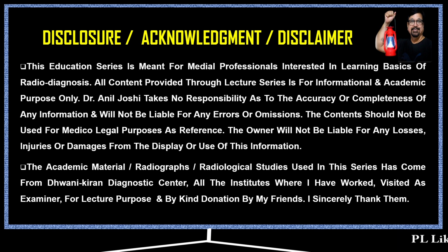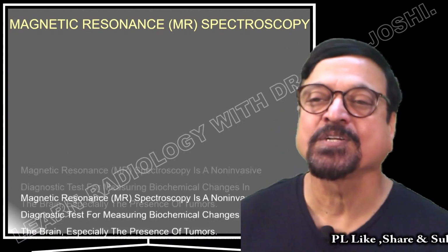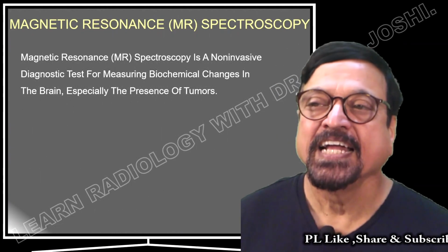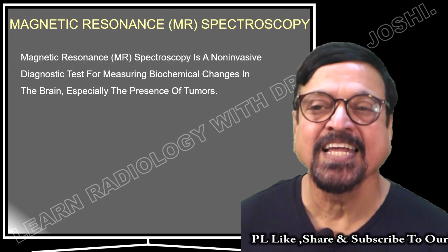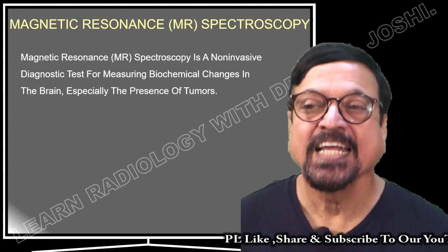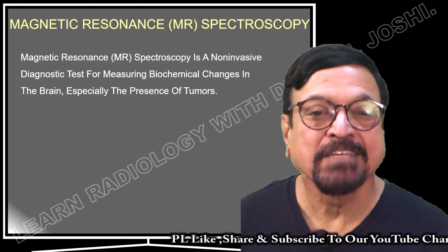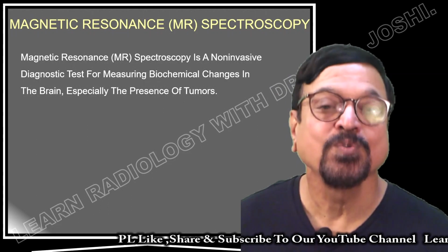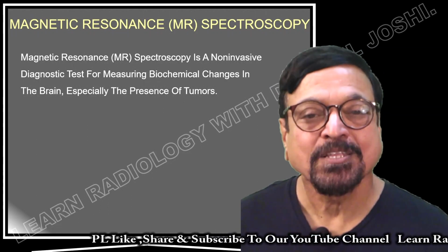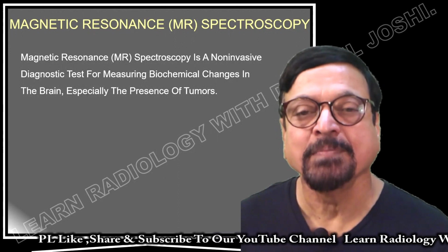With this brief disclosure and acknowledgement, let's get going to the topic, that is spectroscopy, MR spectroscopy, magnetic resonance spectroscopy. It's a non-invasive diagnostic test for measuring biochemical changes in the brain, especially the presence of tumor. So, what is the prerequisite? There has to be certain biochemical changes, and two, there has to be certain pathologies. Now, each pathology produces different type of biochemical changes.